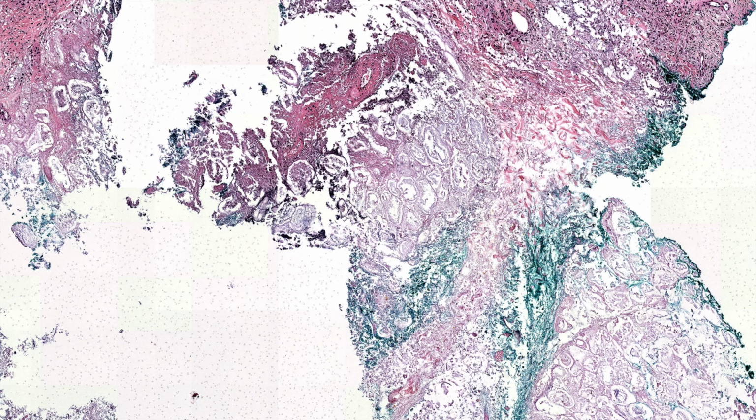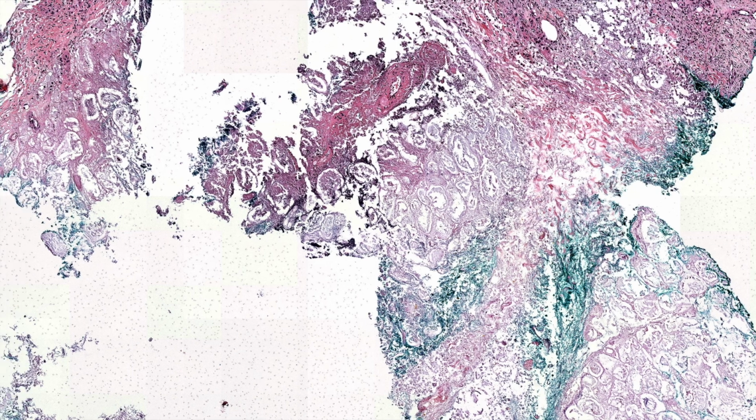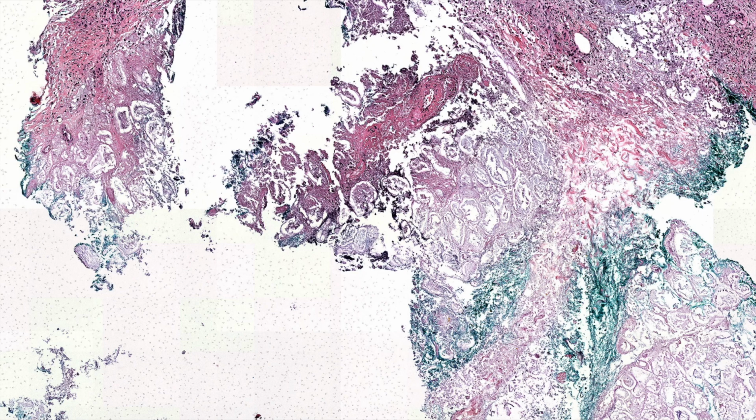So I thought, why is this? This is strange to have this pattern just randomly. And then I looked up, and the patient had a history of pancreatitis a couple of years prior to the case. My theory is that the patient got pancreatic panniculitis there while they had active pancreatitis, and then after it resolved, it got walled off and turned into something like encapsulated fat necrosis, but it had the saponified pattern in it. And I've seen it also in the omentum around the GI tract. Same thing, it had this unusual pattern. A GI path colleague showed me, and it turns out the patient had pancreatitis in the past.